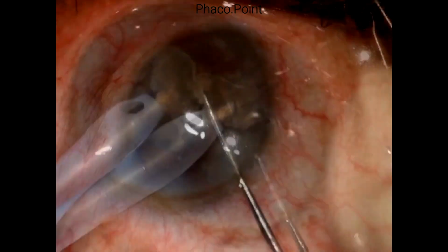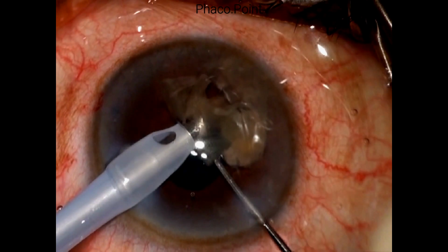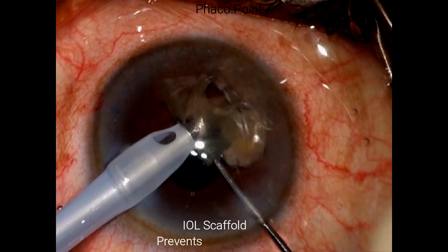with a dispersive viscoelastic. I think it's important to remember that if you choose to emulsify the nucleus in the anterior chamber, there's a significant possibility of damaging the corneal endothelium. So should you choose to do so, it's important to intermittently keep injecting a dispersive viscoelastic to protect the corneal endothelium.